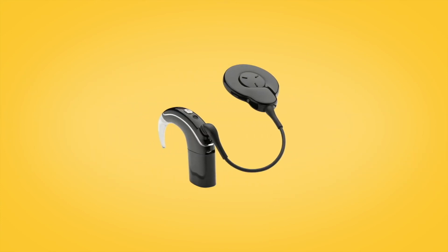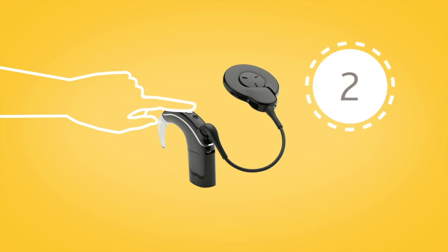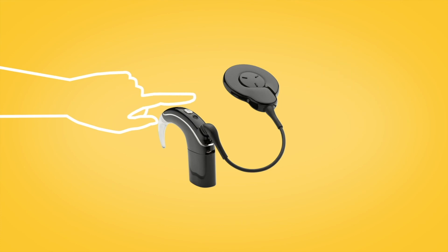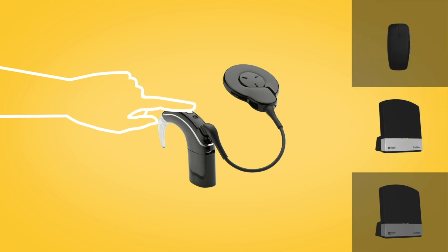If you have a Nucleus 7 sound processor, you can choose from up to 3 streamed audio options using the button on your sound processor. Press and hold the button on your Nucleus 7 sound processor for 2 seconds to cycle through telecoil, if enabled, and then your true wireless devices in the order in which they were paired to your processor. You can stop streaming by short pressing the sound processor button.